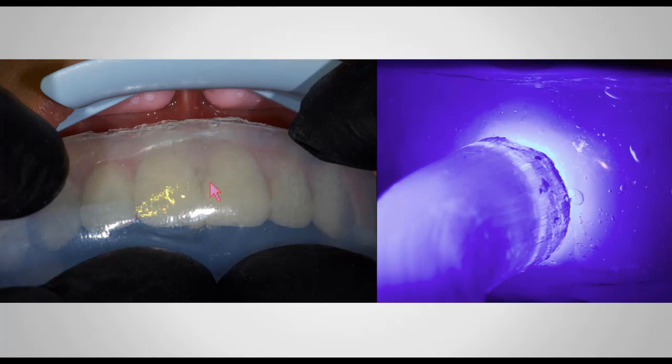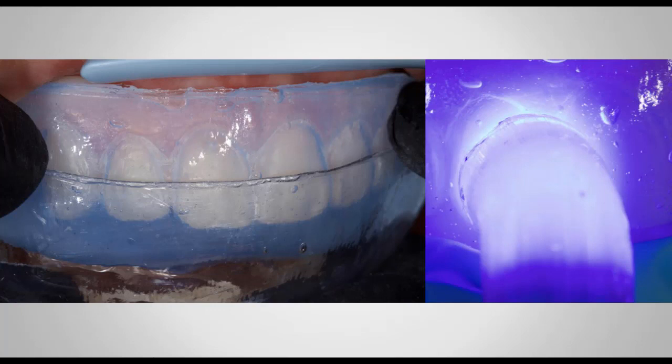Once it's fully seated, you keep it in place, and now you're going to start light curing through the clear triad and the clear PVS onto the flowable composite. So you don't remove the clear triad, you leave everything in place, and you start curing every single tooth for 20 seconds from the facial aspect. Once you're done with that 20 seconds per tooth, then you're going to remove the clear triad. And that's what I'm doing right here.